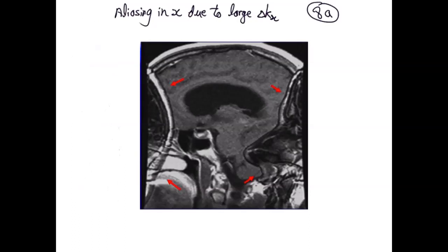If you're studying a whole cohort of people, do you have to prescribe this for each subject individually, or do you set one value for the whole cohort? So good technicians will set separately, they'll optimize for each subject. Sometimes, in order to speed things up, some prescriptions are just set to the maximum. So it's probably not ideal for smaller subjects, but it would be sufficient for larger subjects. So again, the answer is? It depends.